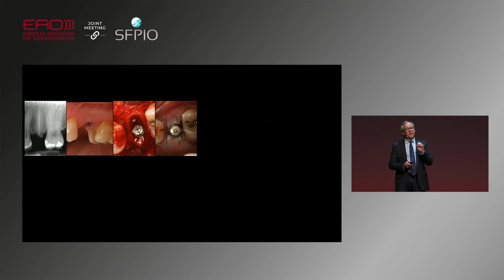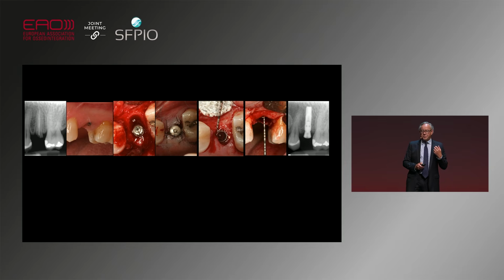So with this information we gathered, we began to develop a well set up protocol of how we had to place our implants, and we need space between the implant and the bone. Probably the bone doesn't like to be very close to titanium.